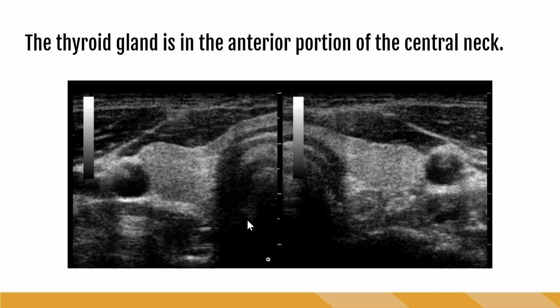In this example, we can see that the sonographer used dual screen to, again, take a picture of the right lobe of the thyroid, move to the left side, get that picture, and then try to line them up at the isthmus level.